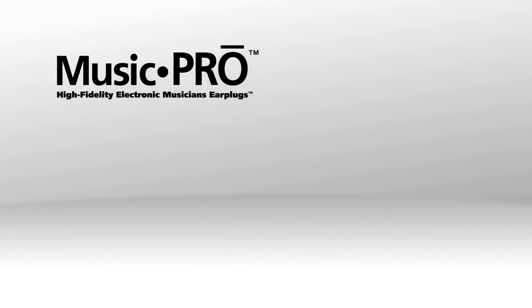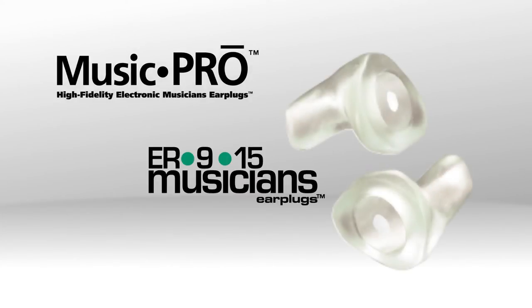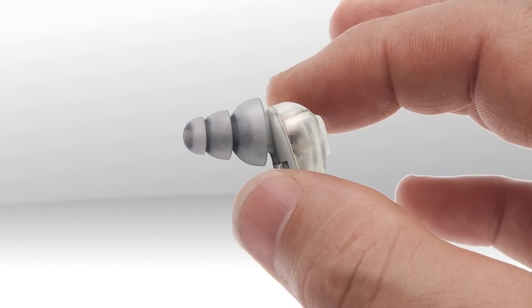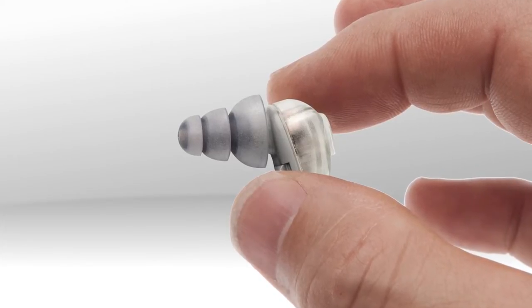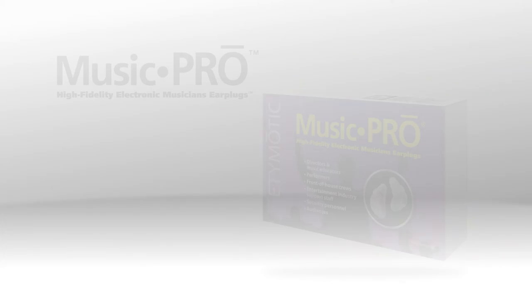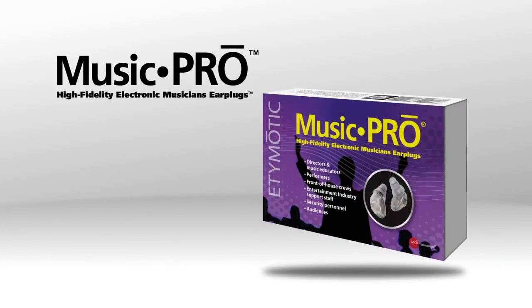Music Pro Adaptive Electronic Earplugs offer the performance of the ER9 and the ER15 Passive Musician's Earplugs combined in a single device. Music Pro Earplugs allow natural hearing when no noise is present and automatic protection when safe levels are exceeded. The following instructions make operating the Music Pro quite simple.